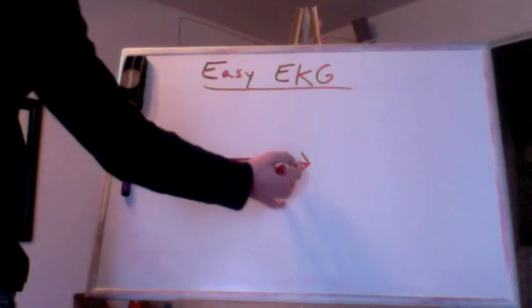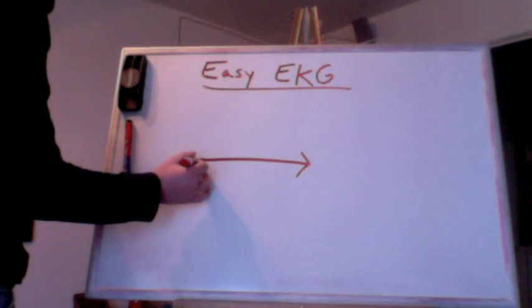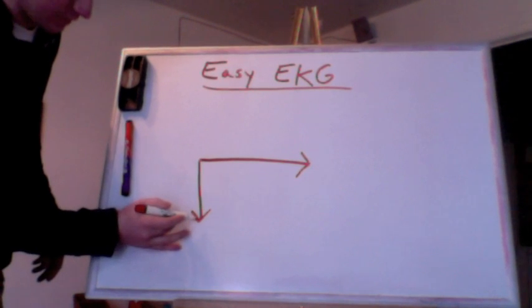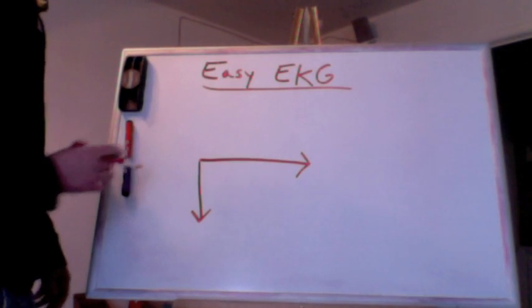So if you have this vector here, that means we're pushing our force this way across the board. If we have another vector going this direction here, that means our force is going down, and it's probably about half of the force of this one, but they're completely perpendicular.